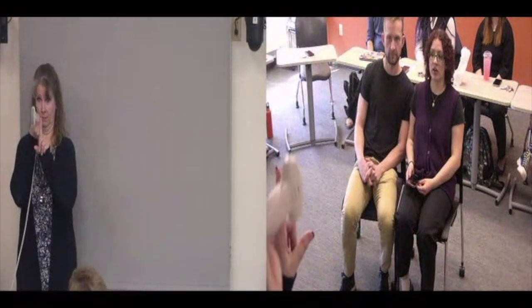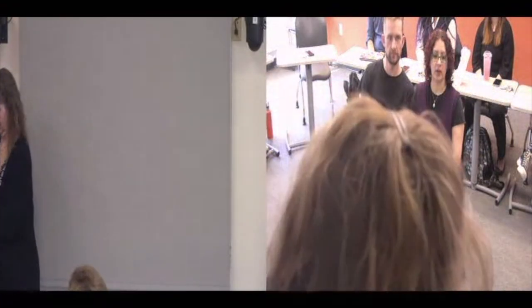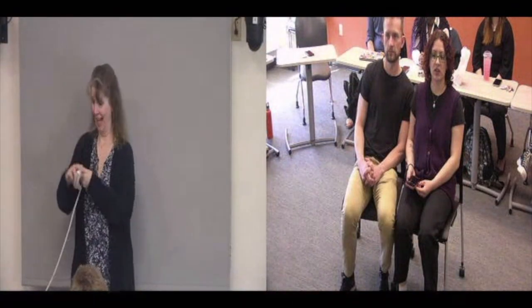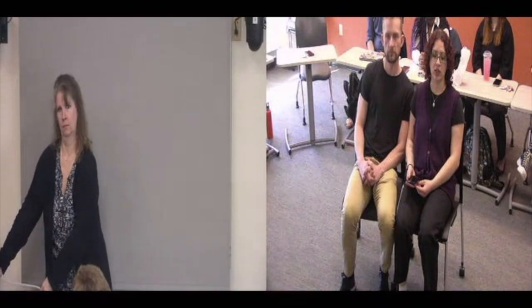Now we control the orientation of our machine right here. Be it sagittal or transverse, that's in our control, and you'll see the three planes utilized. So sagittal is going to look like this. Transverse will look this way. And then coronal is going to look like this.